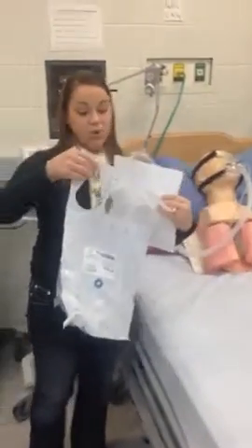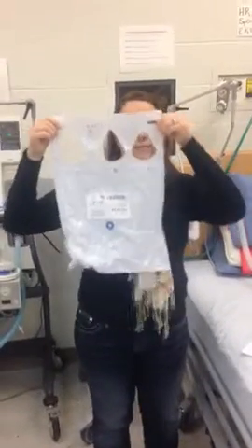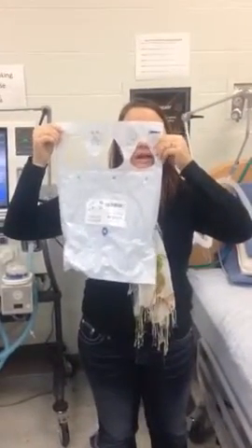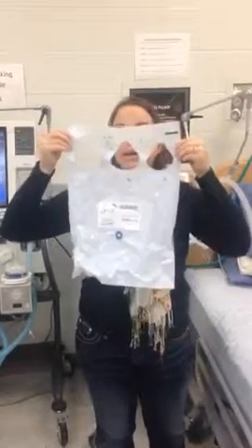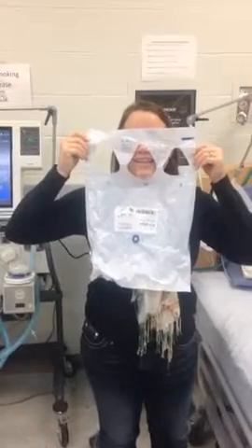I would fit her using the plastic guide on the packaging, starting with the small because she is a small woman and going up. This is how you basically put the nose and chin through there. The small would be a little bit small for me, but the medium would be just right. It is on the bridge of the nose and down tight on the chin. I fit her and she wears a medium mask comfortably.